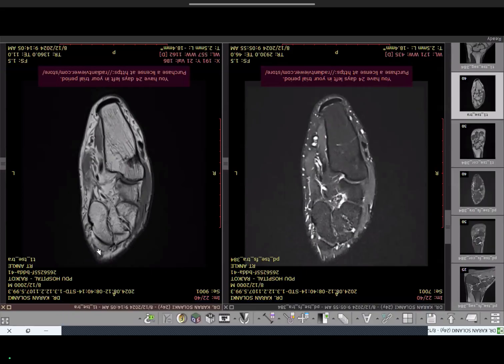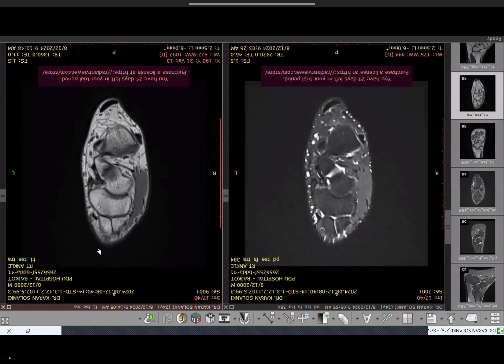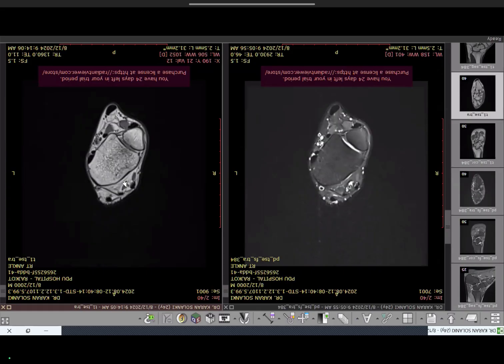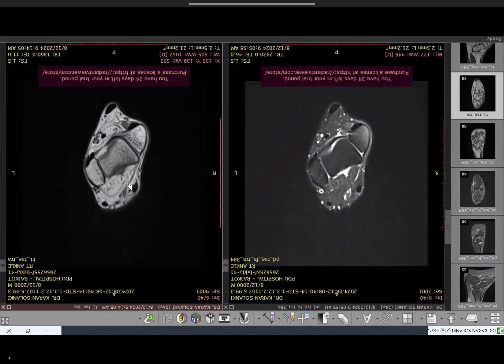The extensor hallucis longus goes more distally to insert at the big toe. The FOV should not include both the ankle and foot in the same sequence; if there is a complaint at the insertion level, take a separate foot MRI. This is the deep peroneal nerve just below the extensor hallucis longus tendon. Then we have the extensor digitorum longus, which divides into slips, and just below is the extensor digitorum brevis muscle — an intrinsic muscle of the foot.